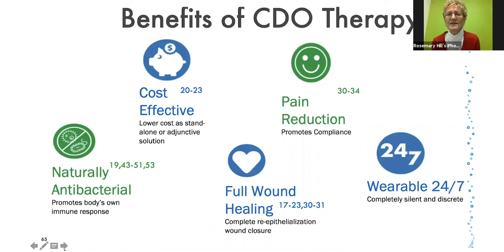But just in summary, let's touch base on some of those summary thoughts when we think of this modality. It is cost effective. My patients with the neuropathic foot and the lady with her breast didn't have considerable pain issues, but Kathy's patients did. And so it's really remarkable about the fact that people are using less narcotics when they're reaching for the continuous diffusion of oxygen. It is naturally also antibacterial, and there is full wound healing. You would wear it 24/7, and the unit is light, with a carrying case, and easily chargeable. So the second generation models are much more user friendly.